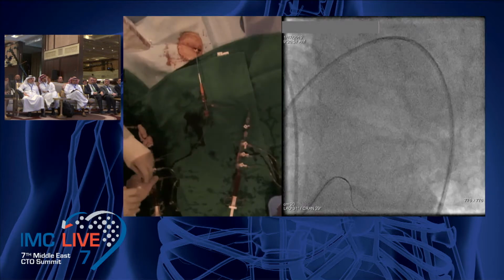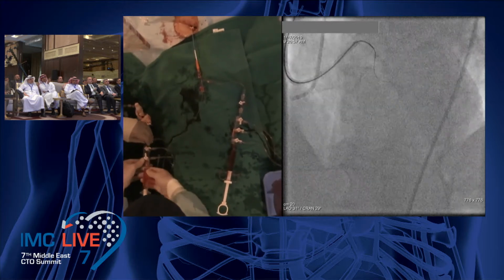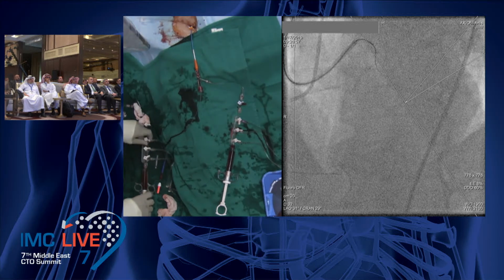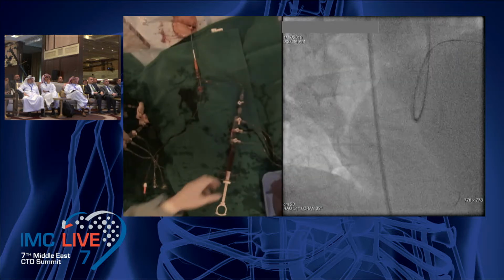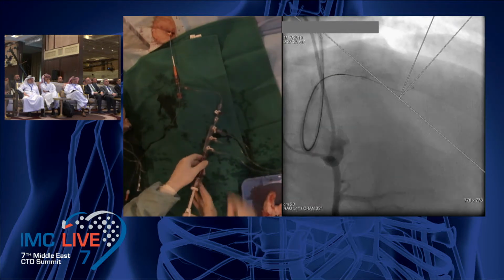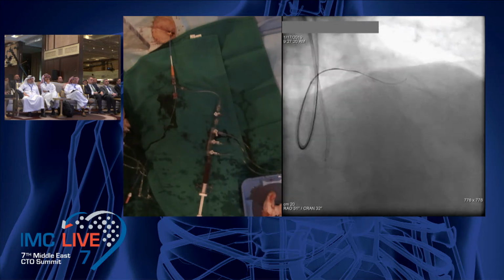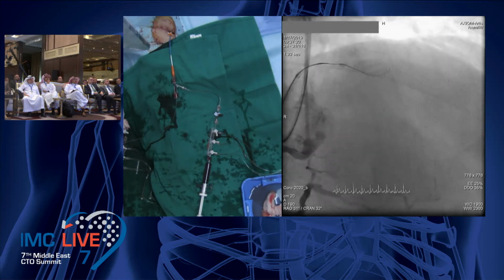So we check here. Two options. Maybe it's a septal branch, or we are in good position. Okay, but epicardial, or we are not in the same plane as the calcification? RAO cranial, yes. Okay, this one is good. So I think we are in the diagonal. Or septals? Yeah, septals. Maybe it's septals, no? Okay, but we still can go somewhere.